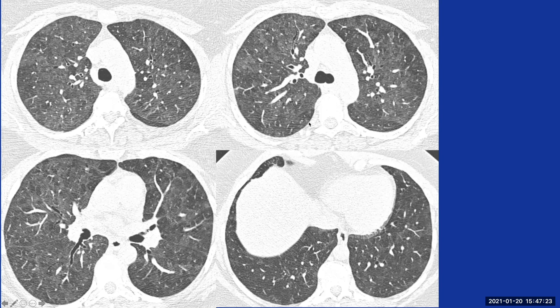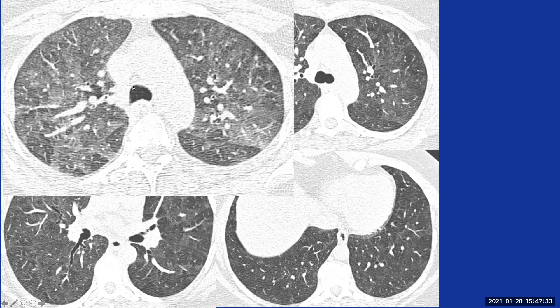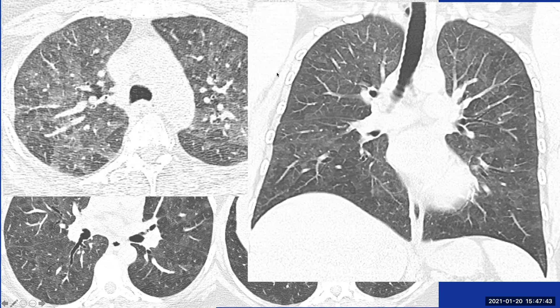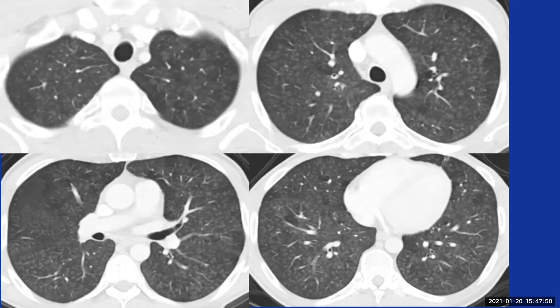Here we see diffuse ground glass abnormality with superimposed mosaic attenuation. On expiration, these areas of mosaic attenuation represent air trapping — they stay equally black on inspiration as on expiration. On the coronal plane, we see this is indeed a diffuse process in both the superior-inferior direction and the axial plane. This is typical non-fibrotic hypersensitivity pneumonitis.